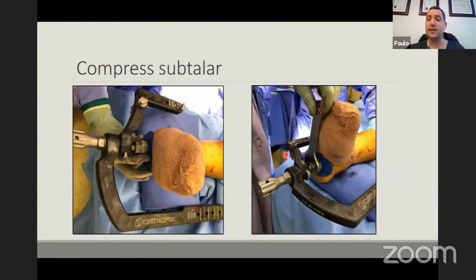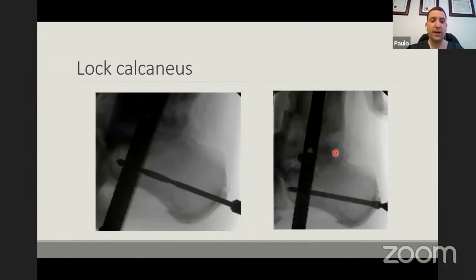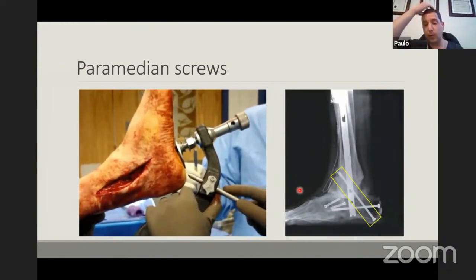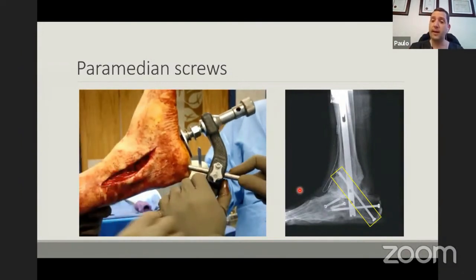Once compressed, now you compress the subtalar joint using the external compression — most nails have a heel pad and you tighten the bolt to compress the joint. Once I'm happy with my compression, I start with my lateral-to-medial screw in the calcaneus and finish with my posterior-to-anterior screw, which is the important one. Usually the nail is in the anterior third of the calcaneus and you've got very little room to grab purchase distal to the nail, so I want to make sure I get into the lateral portion of the calcaneus and get as much bone contact as possible. Some systems allow you to put paramedian screws — two screws on either side of the nail going from the calcaneus right up into the tibia. This is really useful when you've got big bony voids with allograft in place, adding more stability to the construct.